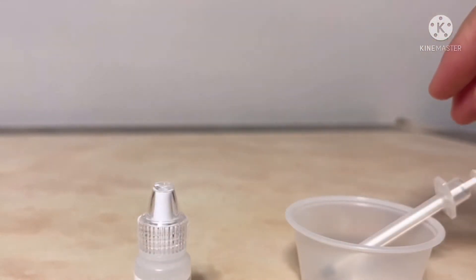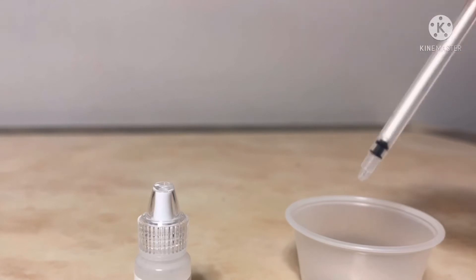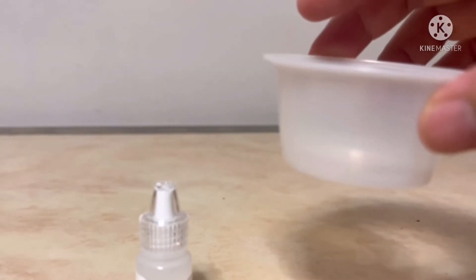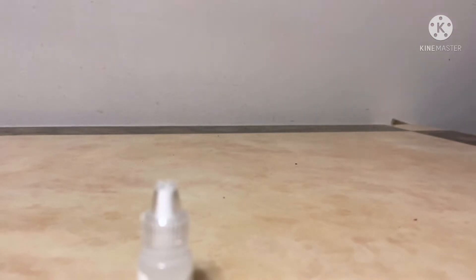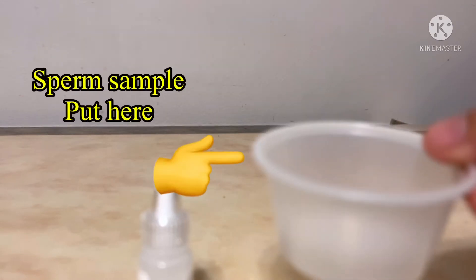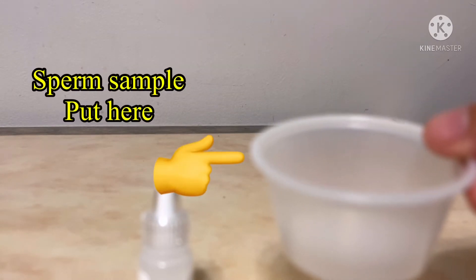This one is the sample transfer tool, and this one is the sample collection cup. So if you're ready, tell the patient to stimulate through masturbation and put the sample in this cup.